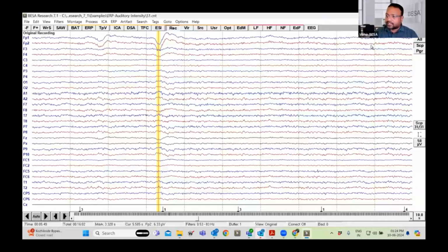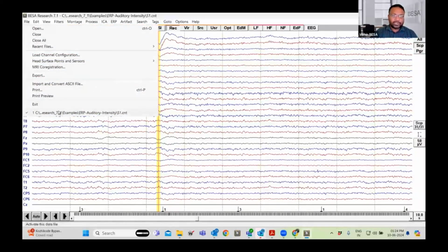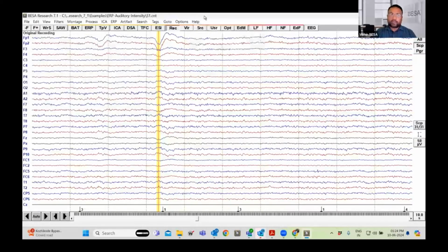So that said, let us go to the montages. Typically when I go to customer sites, or when I meet my clients, the first question they ask is, what is this minus F and this plus F on the ribbon? When I have multiple files loaded, using this minus F and F plus, I will be able to switch between these files. In this case, I have only one file opened. At the bottom, you can see I have just opened one file, and that is why I'll not be able to switch between the files. But later on, I will show you when we have more than one file, we'll be able to switch between the files by just using these buttons.